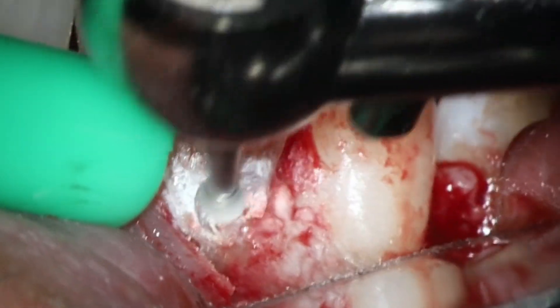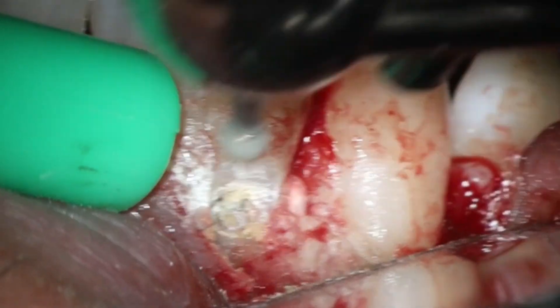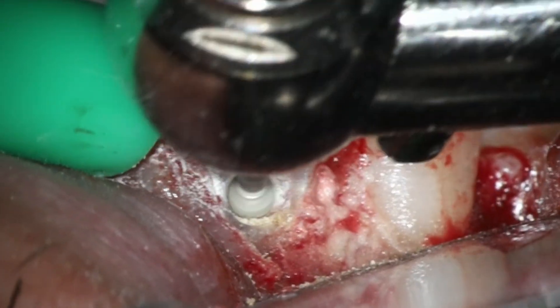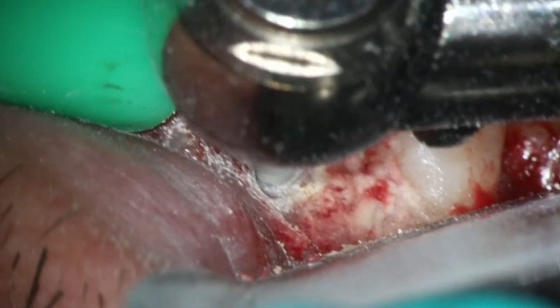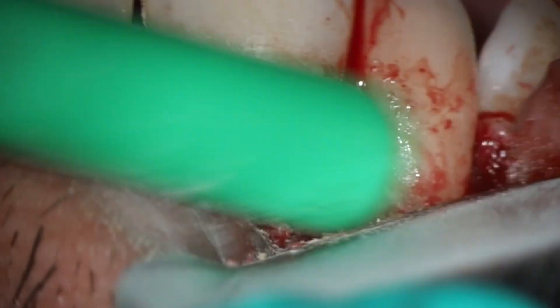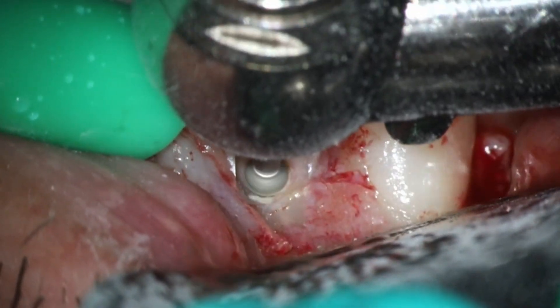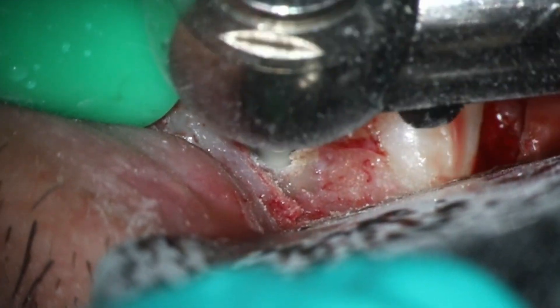Starting off with just a round diamond, what I'm going to do is kind of brush up almost a little bit higher than you would think, because what I want to be able to do is hide the transition from the tooth to the composite itself. You'll want to get a shade before you do anything here, because even putting the rubber dam on is going to dry out that tooth, which will affect the shade. This was an A2, which is what we're going to use to repair that. You want to make sure you use a nice color that's a little translucent, but also not too translucent — I've made that mistake before. We're going to be using Shofu's product here, and you'll see that in a few minutes. What we're doing is slowly going in and starting to remove that resorptive area. You can see it's really not bleeding inside there, which makes me feel confident that the calcium hydroxide hopefully did something.